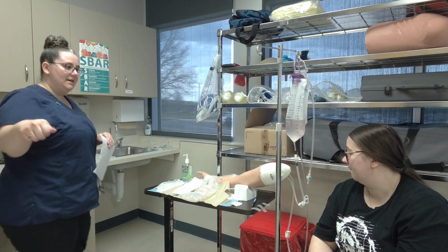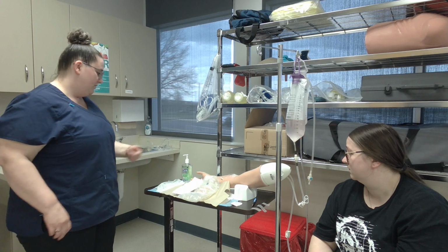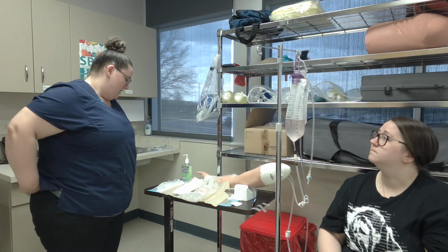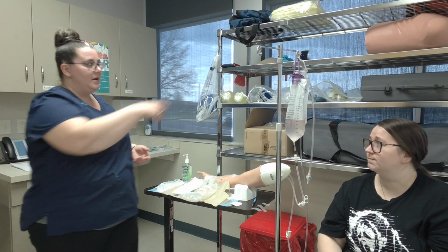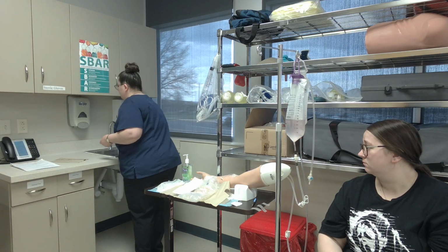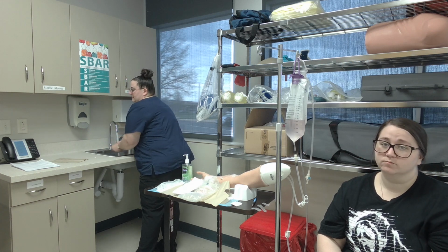All right. Knock, knock, knock. Hi, my name is Amber. I am going to get your medication ready, your IV normal saline ready to put into your IV. Does that sound okay with you? Okay, I'm going to close the shade for privacy. I'm also going to provide hand hygiene, so I'll wash my hands. Do you have any questions?